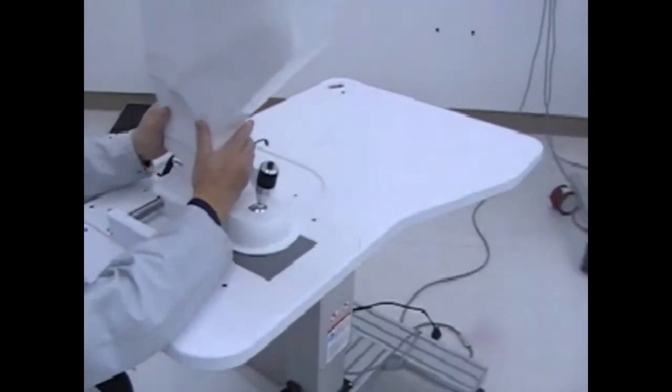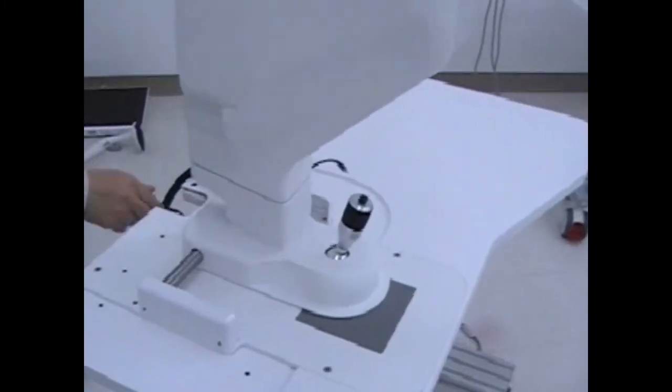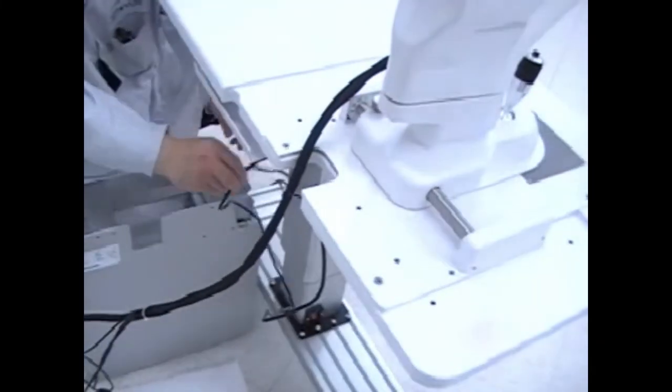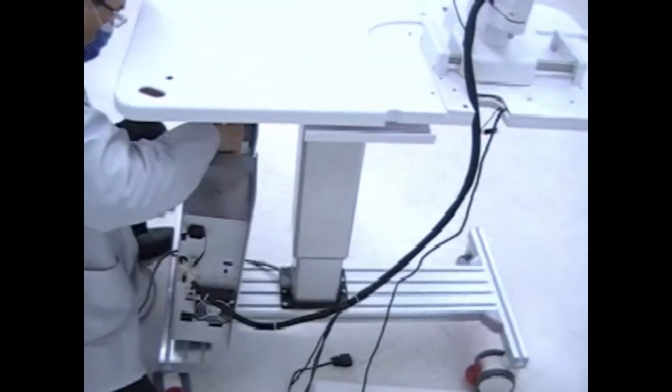Make sure that the head is all the way down to the joystick assembly, then take the control box. Be careful because it's heavy. Position it under the table, lift it up, and slide it onto the hooks.